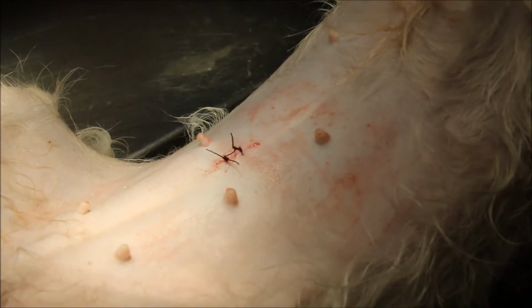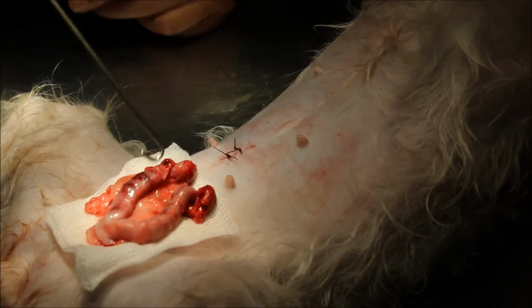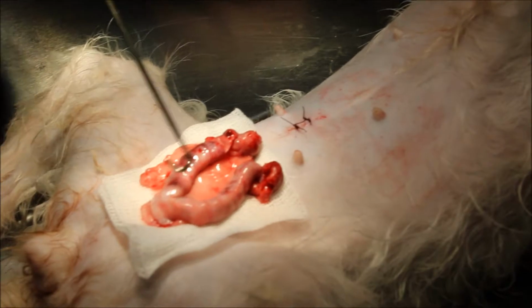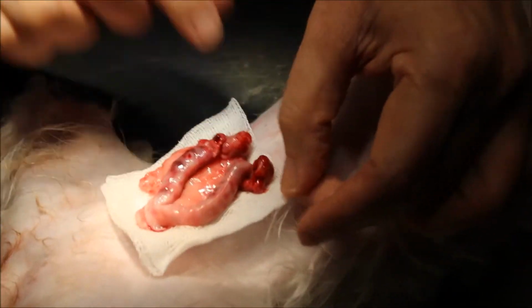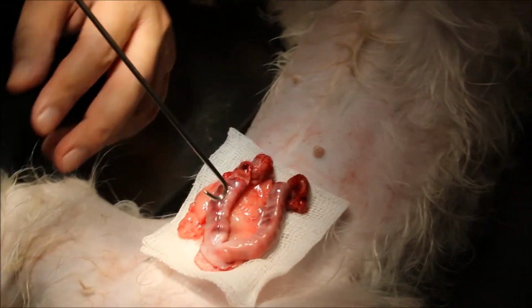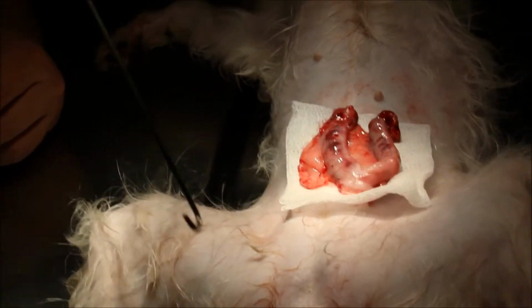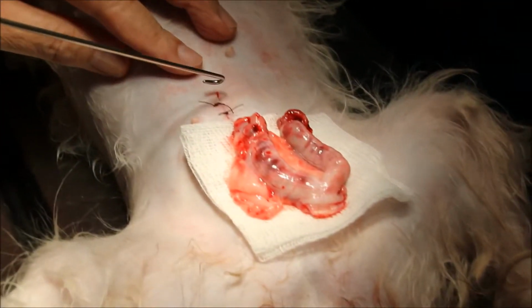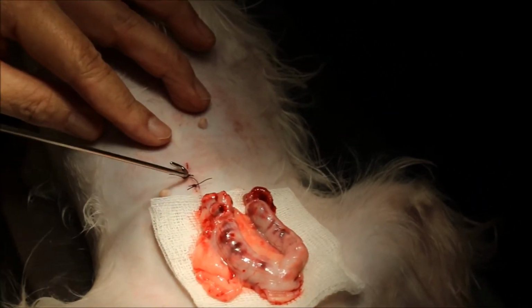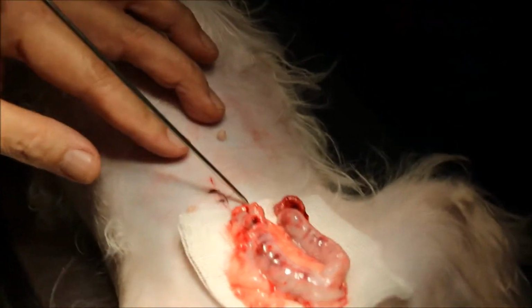Now, as you can see, this is the ovary and uterus. You have to hook up. Okay, so the ovary and uterus will be actually here this way. Then when you incise, you come out inside already. When I do the skin incision, then I cut into the linea alba and the muscle and separate, and then I have to hook. So you come to my side, I'll hook in. So I have to hook up the uterus.